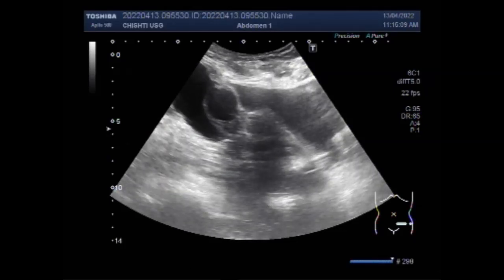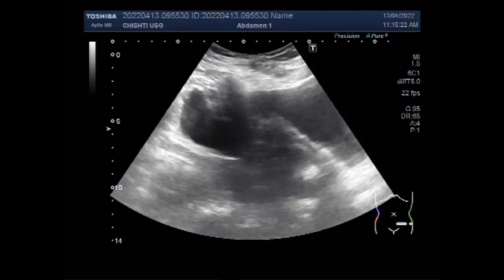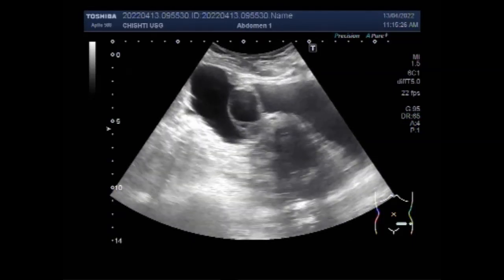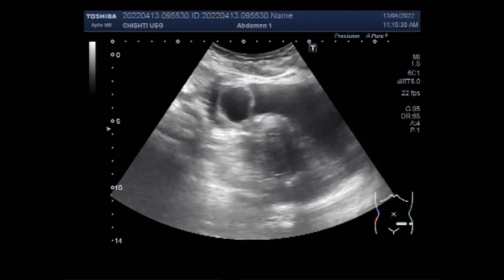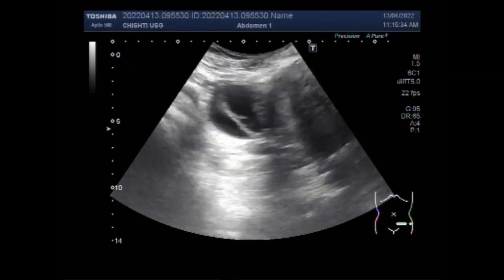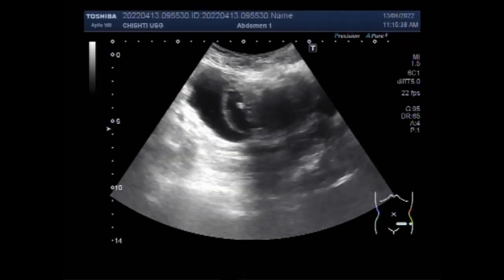Now you will see the ovarian cyst has another cyst inside it — that is called the daughter cyst. A simple cyst is typically round to oval, anechoic, and has smooth thin walls. It contains no solid component or septation, with rare exceptions, and no internal flow is visible on color Doppler imaging. For cysts less than 3 cm, no action is necessary — the cyst is a normal physiological finding and should be referred to as a follicle.